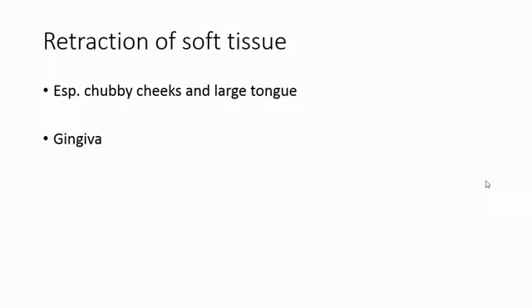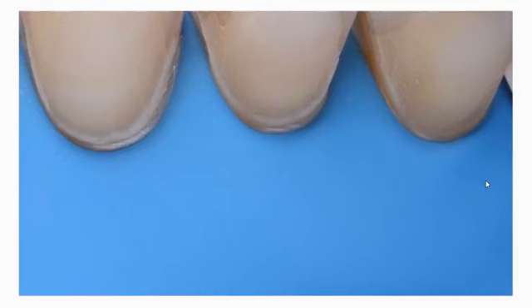You remember a patient in which a large tongue used to be always covering the surfaces of the tooth, which we are doing either a normal filling procedure or an endo procedure. And a lot of retraction you need to do with your retractors, mirrors, and all. And also the gingiva which keeps on oozing out, or a lot of secretions of the bulky gingiva which used to hamper the restorative procedures. तो ये सारी चीजें, ये retraction मिलेगा तो your treatment procedures would be very simple.